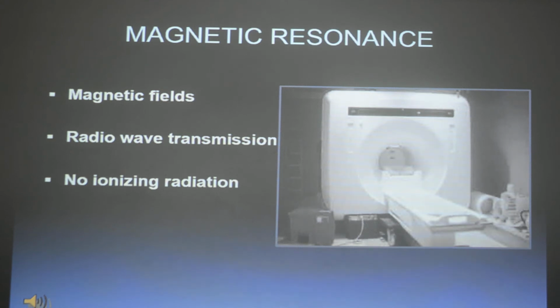Now, just because you haven't read about MR, I'll give you a layman's explanation of how an MR works. Actually, the human body is 2/3 water. Okay, the water is H2O. The H2 is protons. Okay, this machine has a giant magnet. You can call it 1,000 times stronger than a routine magnet that you know of. It is measured in Teslas. So we have different strengths of this magnet, say 1.5 to 3 or 5 Teslas.